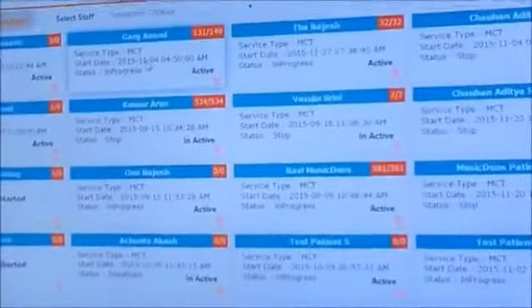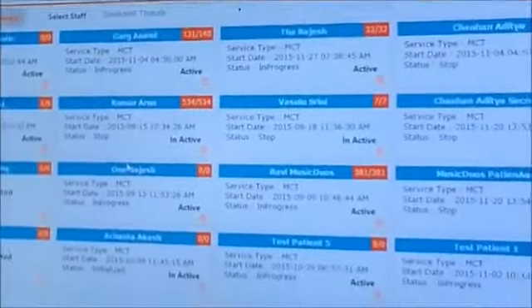So we are logging into the cloud portal, which is a cloud platform we have developed. This same ECG will be showing here. We have just started collecting, and you can see it is already loaded in the cloud.